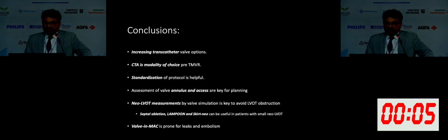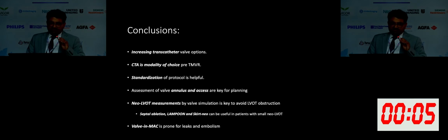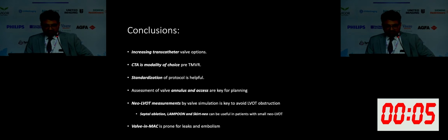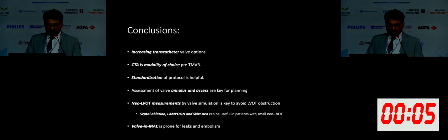Assessment of the valve annulus and access are key for procedure planning. Neo-LVOT measurements are critical if we want to avoid complications of LVOT obstruction. We need to be familiar with septal ablation, LAMPOON, and skirt neo-LVOT because these are helpful in avoiding obstruction. And valve-in-MAC is prone to complications of leak and embolization. We need to be mindful of that.